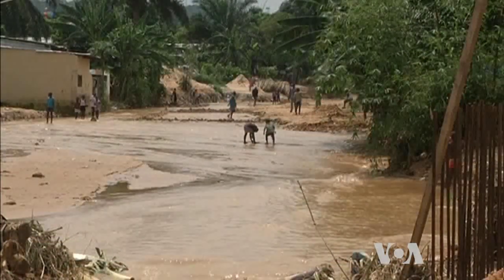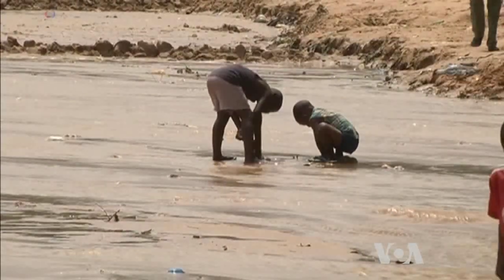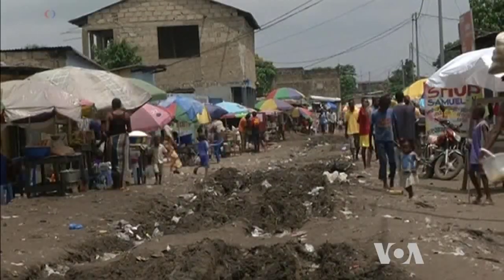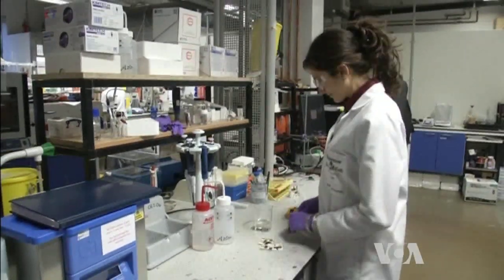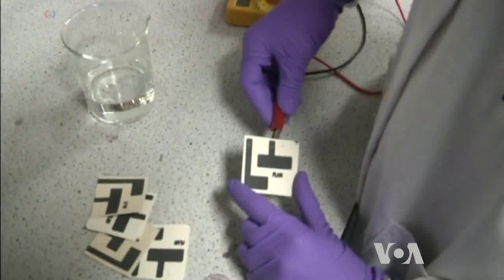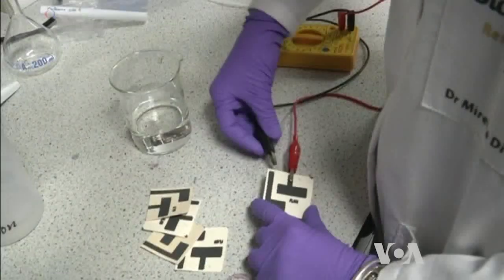Testing water for bacterial contamination is relatively easy, but still beyond the means of the poor people living in affected areas. Researchers at the University of Bath in southwestern England are testing a simple and cheap device that could help ordinary people check their water.